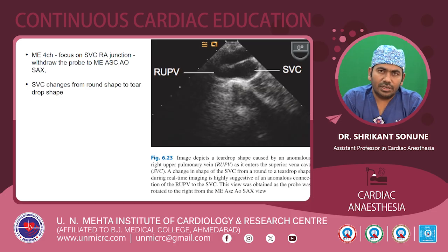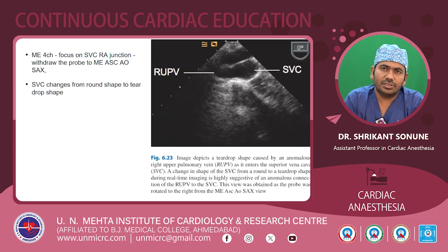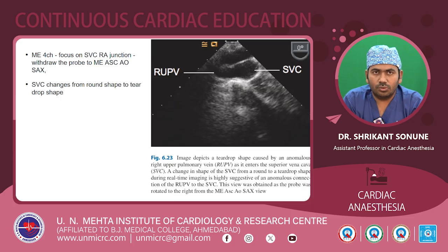This image can be achieved after obtaining a mid-esophageal four-chamber view focused on the SVC and RA junction. You then slightly withdraw the probe to the mid-esophageal ascending aorta short axis view and look for the change in SVC shape. The circular SVC shape will change into a teardrop shape as there is a connection between the SVC and the right upper pulmonic vein.